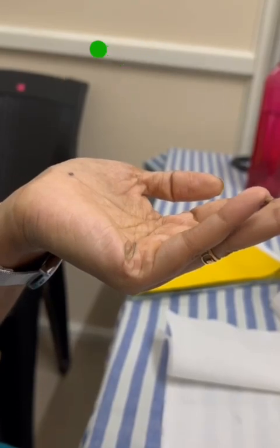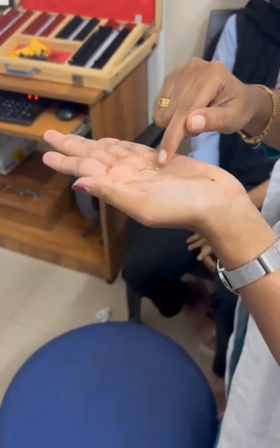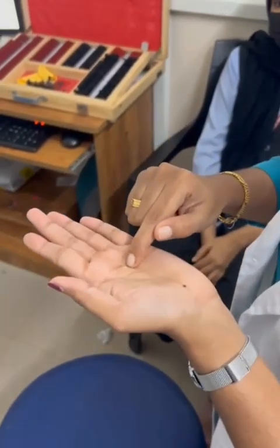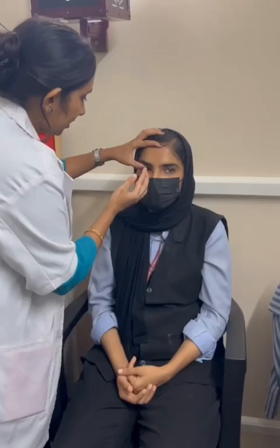If the edge is curved inside or pointing inside, then it is in the correct position. If it's pointing outside, then it is in the wrong way. Before inserting the lens, you should check the orientation to confirm it is correct.